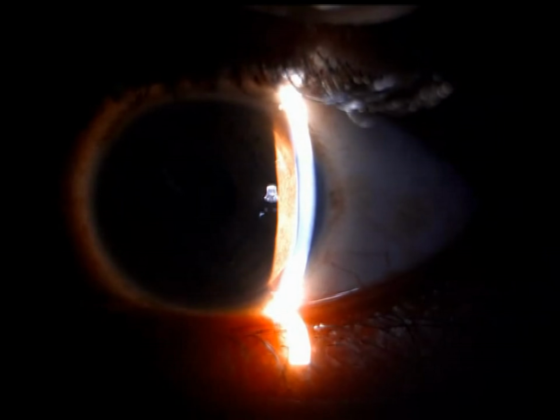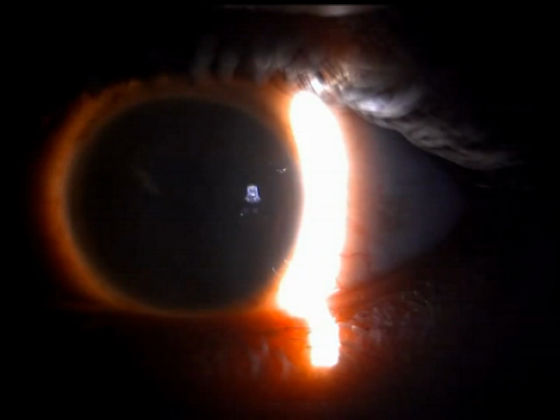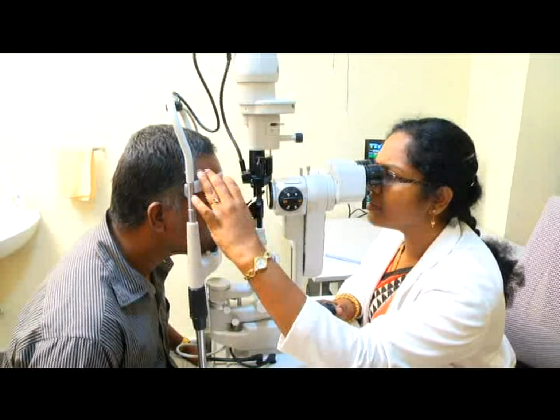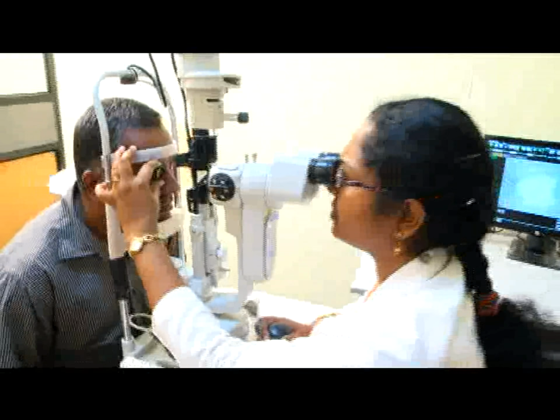Proceeding to sclerotic scatter, in which a narrow vertical slit is directed in line with the nasal limbus. Moving on to fundus examination, the microscope and the illumination system are positioned coaxially with 10x magnification and 90 diopter lens to visualize the optic disc and retina. Here is a picture showing intravitreal foreign body in the posterior vitreous.